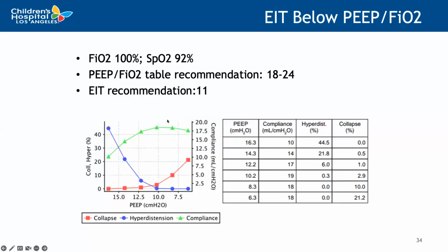And then finally, there are some patients whose EIT recommended PEEP is below that of the PEEP FiO2 table. And I think these are probably the patients that we're most interested in. I think for this particular patient, they were on 100% FiO2, only saturating 92%.